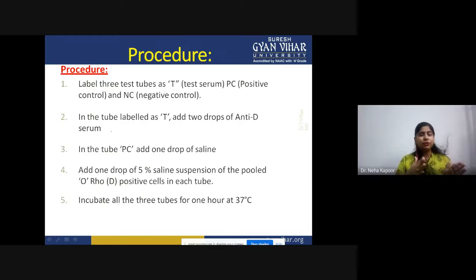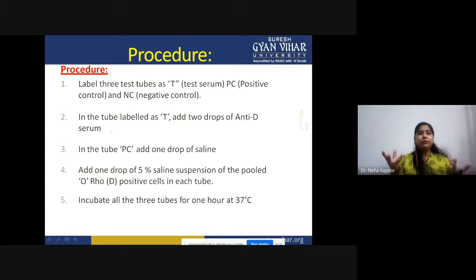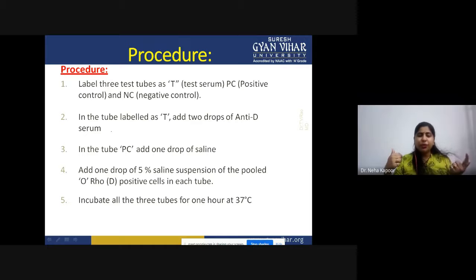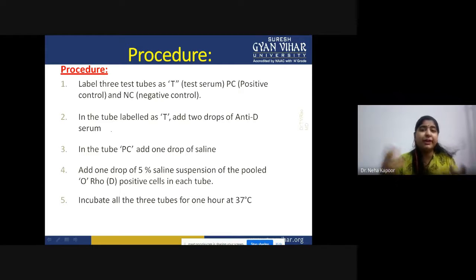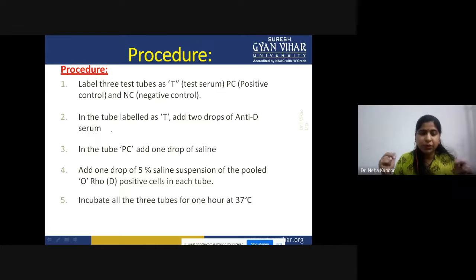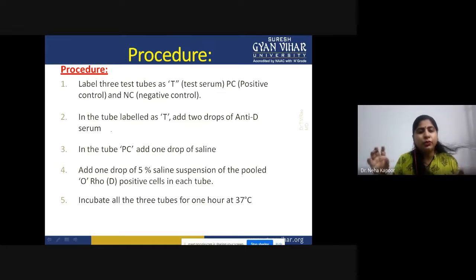Procedure: take three test tubes and label them as test, positive control, and negative control. Whenever you perform any laboratory-based test, you need two controls — one positive and one negative. Positive shows the expected result when the test is positive, and negative shows no result when the disease or antigen is absent. In the tube labeled as test, add two drops of anti-D serum.